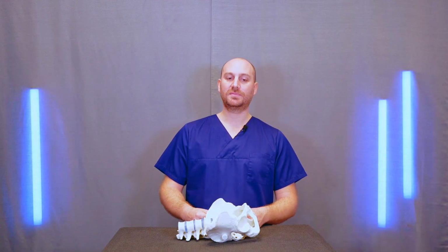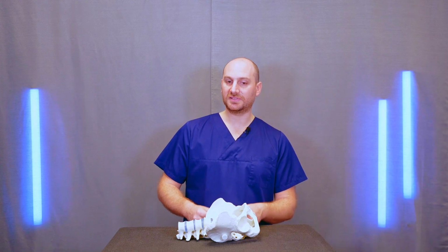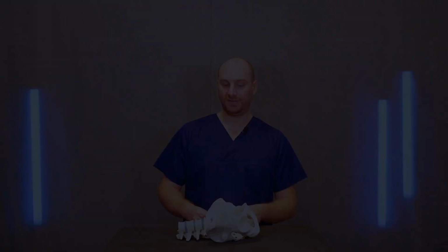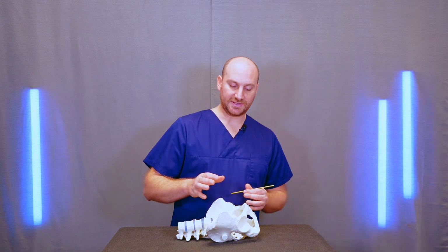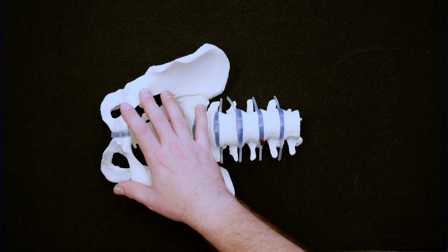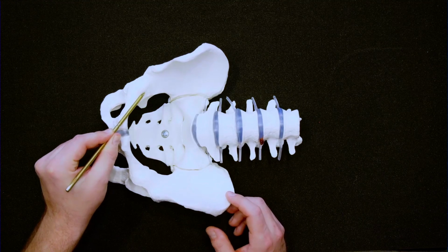I want to talk to you about positioning for percutaneous corridors of the pelvis, because the positioning determines whether you can access your corridor or not. We start with supine position, which is most commonly used in pelvis and acetabular surgery, and so most surgeons are very familiar with this. In supine position, we can access the pubic ramus very easily as a retrograde screw.